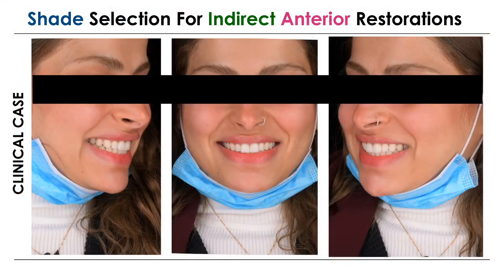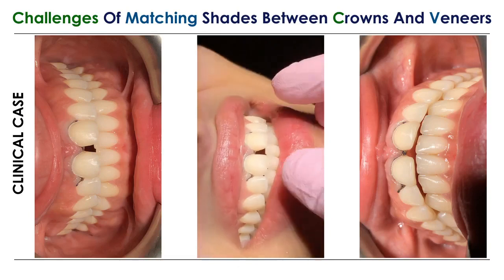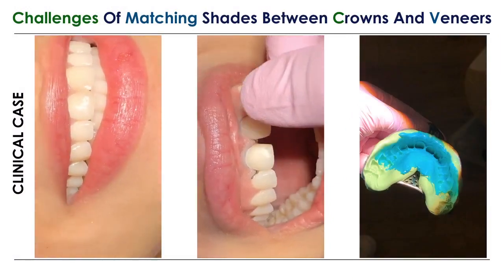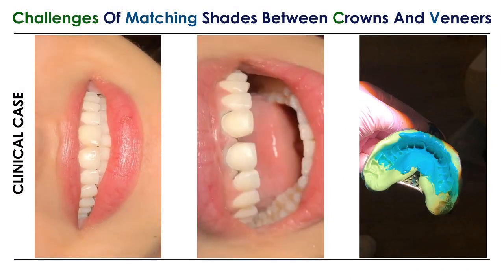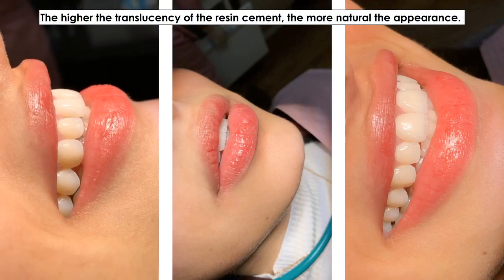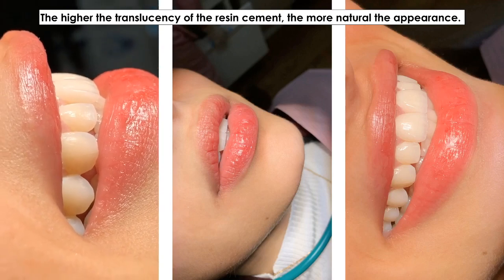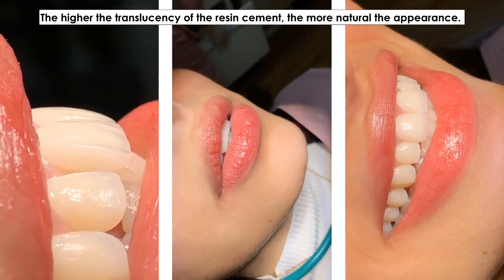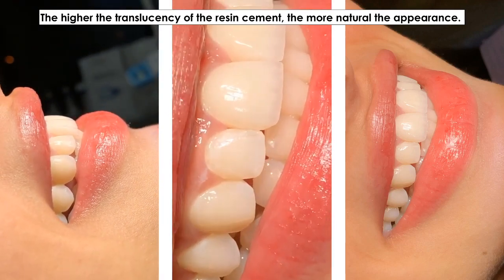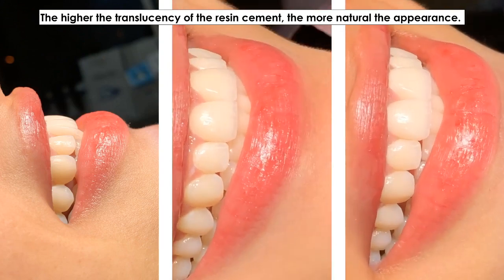I removed her old restoration, and this is the preparation for that case, and this is the temporary, and that is the try-in. We can see in the left video that the value is a little bit lighter than the adjacent teeth. That's why I chose the neutral cement, to modify the final color of the ceramic veneer to achieve a color match in the final result.